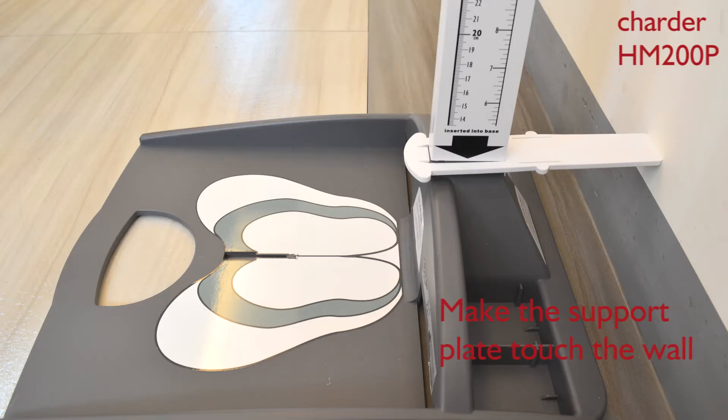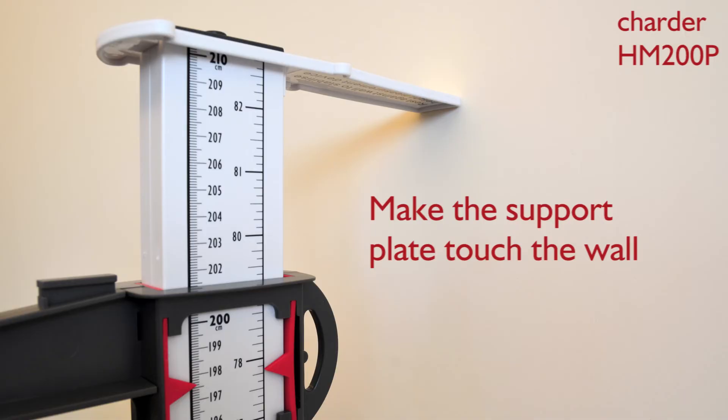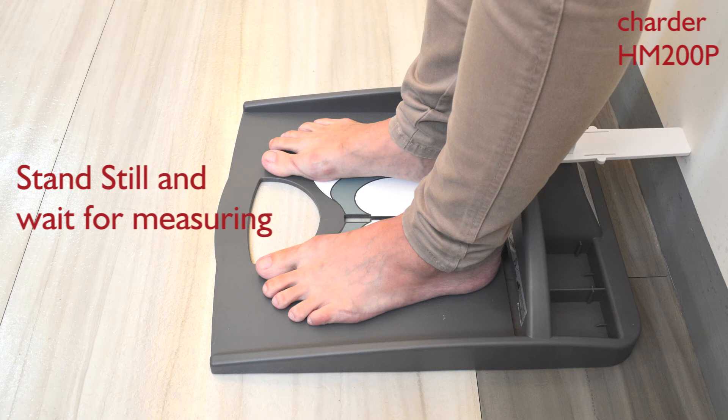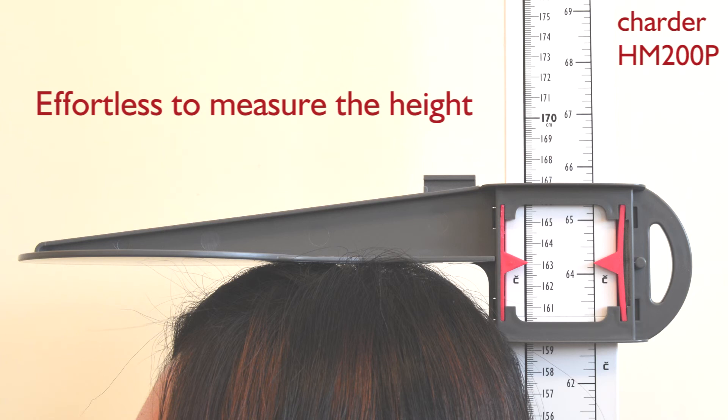Make the bottom and upper support plates touch the wall. Keep the patient be ready and wait for measuring height. Let the head stopper touch the patient's head.